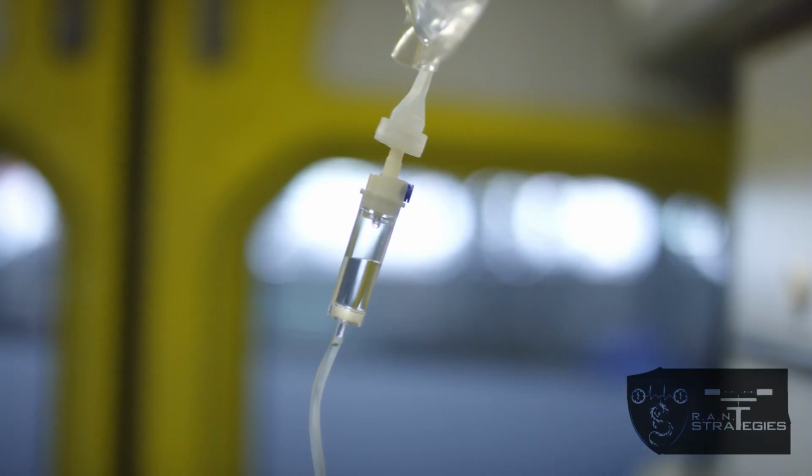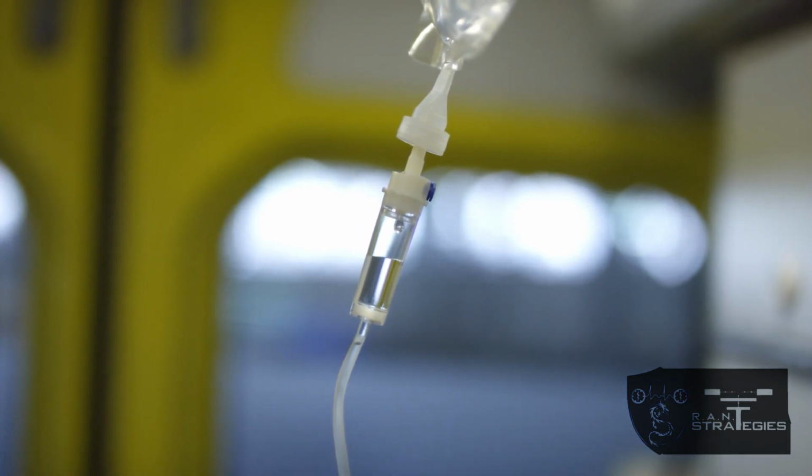So we as paramedics are intimately familiar with intravenous catheterization as we're normally doing multiple IVs on somebody in a single shift. If you can't get an IV, keep your human protocols in mind, because even when it comes to canines, if you cannot perform an IV or gain IV access, consider an intraosseous access on them.